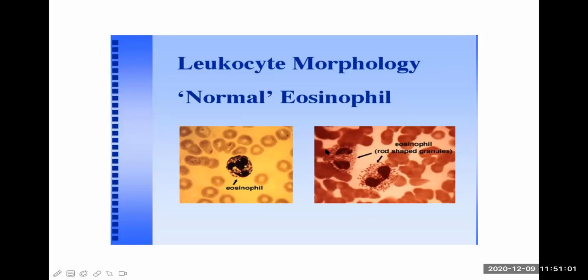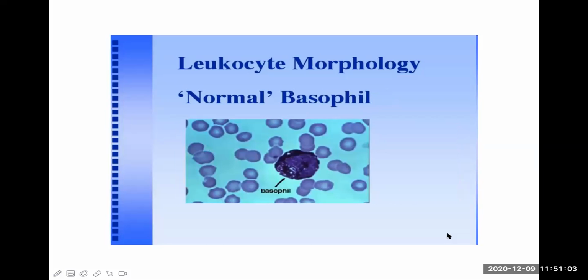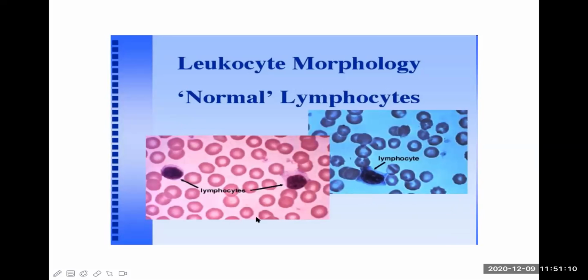This is a clear-cut case of basophil. This is a basophil, no confusion, typical basophil. And these are the lymphocytes. This is an activated lymphocyte.